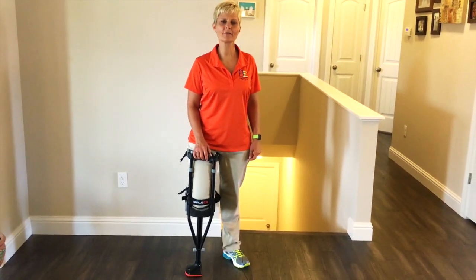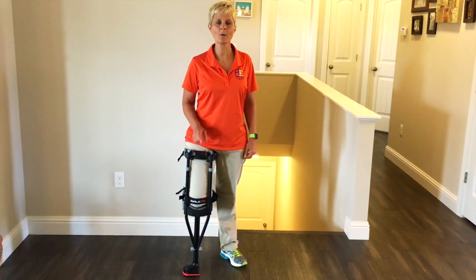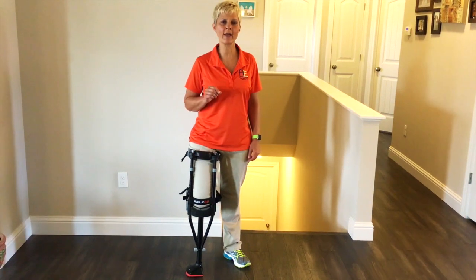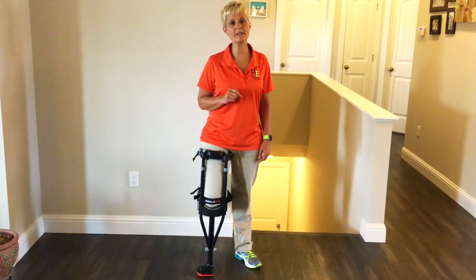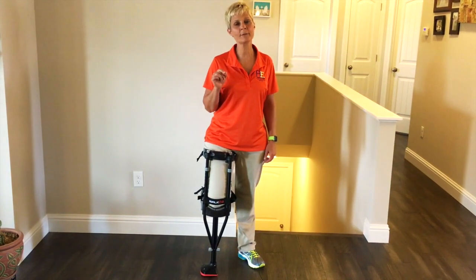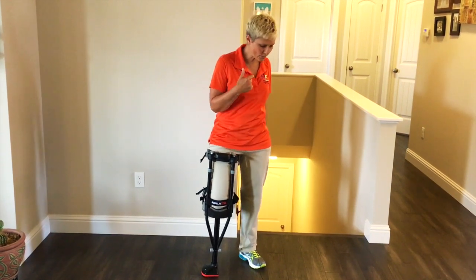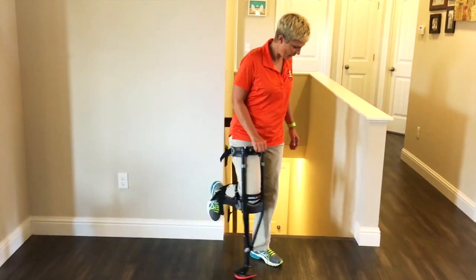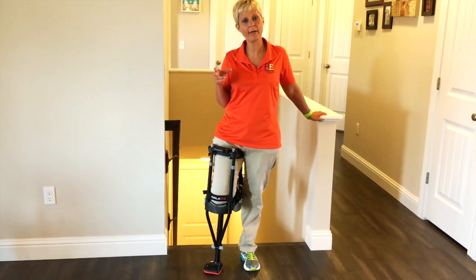Today we are going to give some more food for thought on the iWalk 2 and using it on the stairs. We had a viewer ask about the fact that her railing was on the opposite side of the stairs of the video that we did on how to walk with an iWalk 2.0, and we demonstrated going down the stairs sideways. So if you have questions about that, take a look at that video. So we're going to come over here to the stairs and we're going to see how to go down the stairs no matter what side the railing is on.